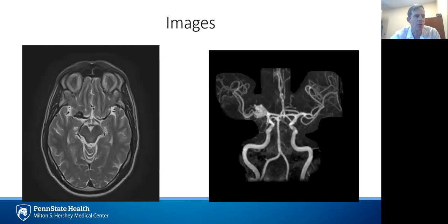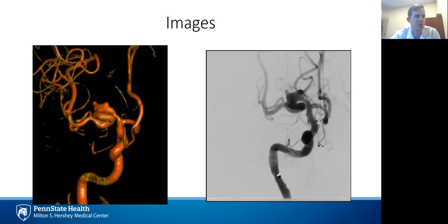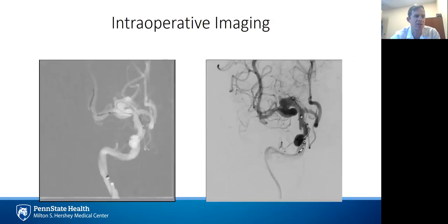As with placement of any flow diverter, proximal tortuosity — whether through a tortuous carotid siphon, or as in this case, a very tortuous proximal MCA — makes for a much more challenging deployment. Adequate proximal support is essential, with an intracranial support catheter used in this case, as you can see here, up to the intracranial ICA.